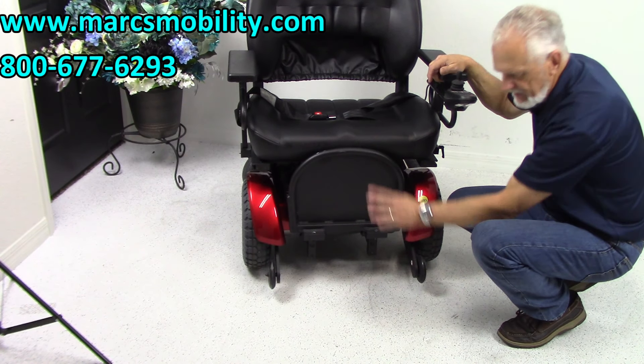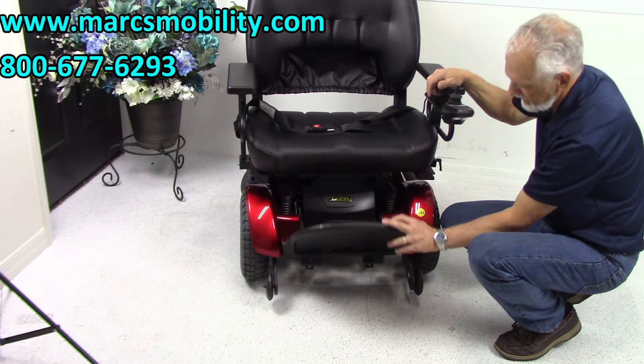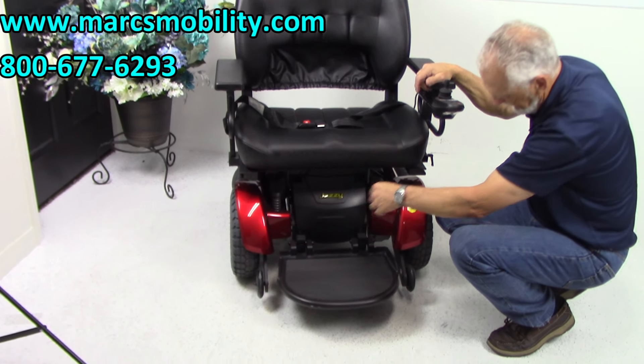There are tip wheels that never touch the ground unless the chair tips forward. You can see the heavy-duty suspension on both sides in the front.